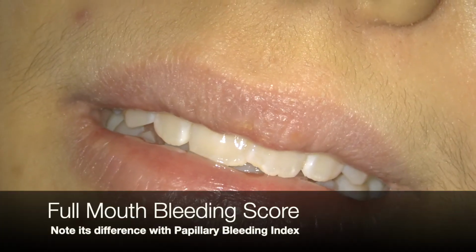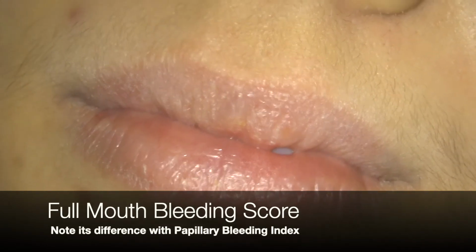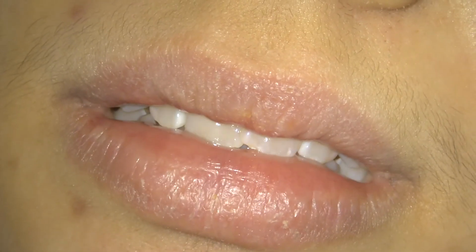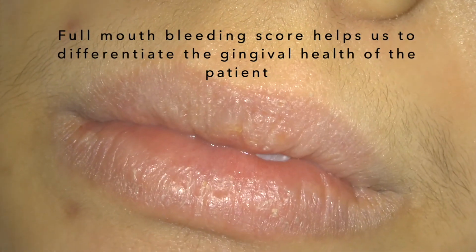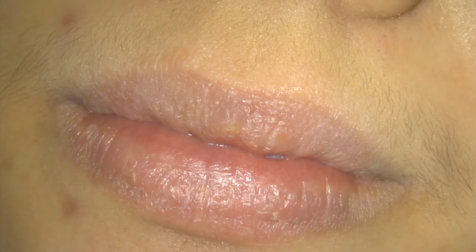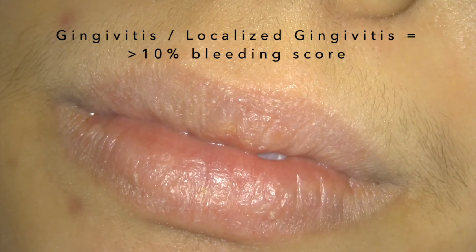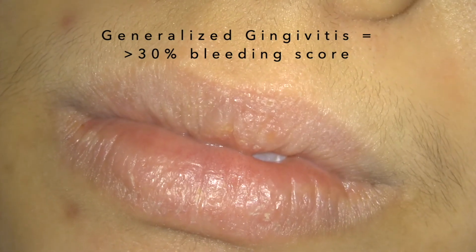Now let us see how to assess a bleeding score in a patient. Assessment of bleeding score is very important because it signifies the amount of gingival inflammation present in the patient. Bleeding score also helps us differentiate whether the case is healthy gingiva, or a gingivitis, or a generalized gingivitis. Even based on the new classification system, if the bleeding score is 10% or more, then you call it gingivitis or localized gingivitis. For generalized gingivitis, the bleeding score must be 30%.